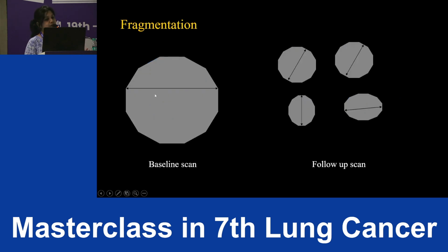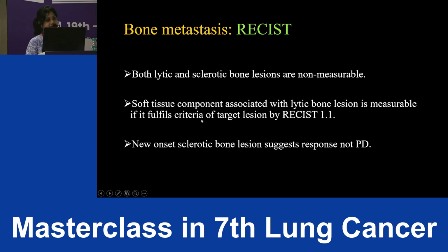Now, if a tumor from the baseline scan on a follow-up scan has fragmented, then you have to measure the long dimensions of all the fragments, add them, and compare it with the baseline scan longest dimension.